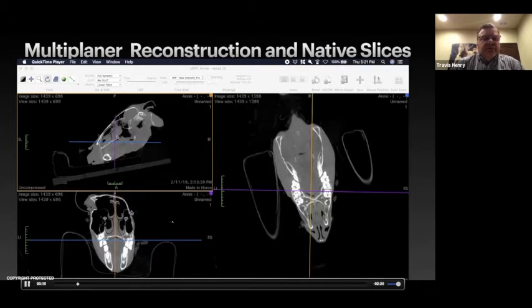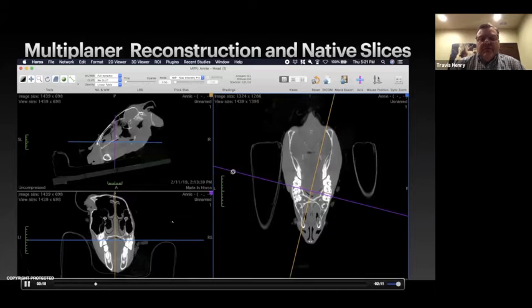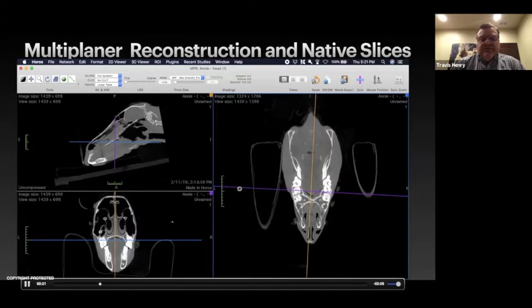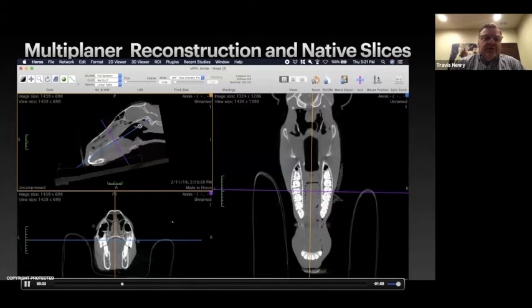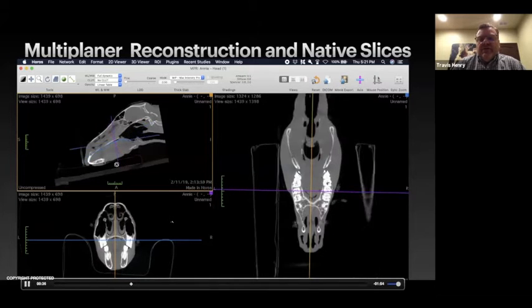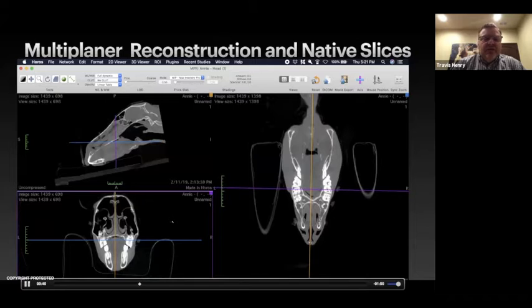So you're going to see us be able to adjust. We're going to grab the rotation device here, and I'm going to spin the horse so that I can get it lined up. And then as you can see, as we move the axis over the dorsal, how our transverse planes and our sagittal planes started to straighten out. And now I'm going to tell the dorsal line on the MPR to flatten out. Now you can see all of the teeth together, but as I turn that back to where it was, you can see how we lose that.